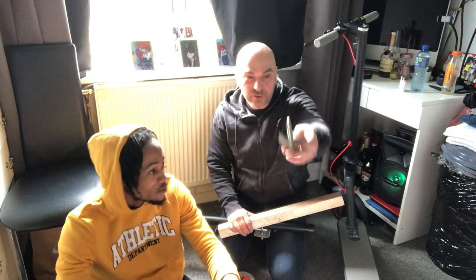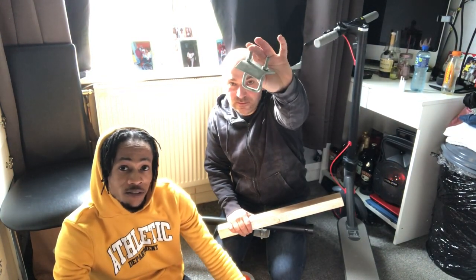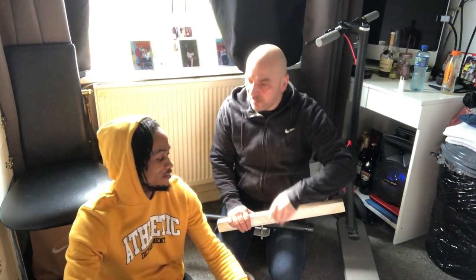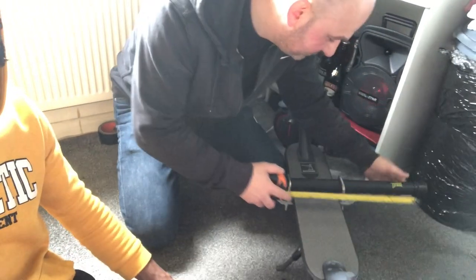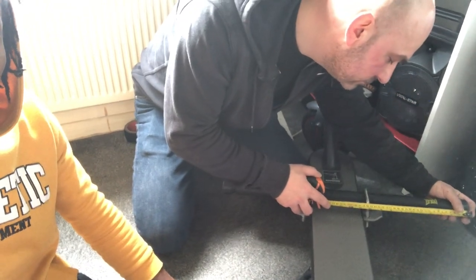So we are going to set it up guys and show you how we are going to set it up. We got very strong clamps, because it has to be very, very strong and safe — that's the main thing. Because this guy is going to ride very fast. So guys, we are measuring it now to get it even.